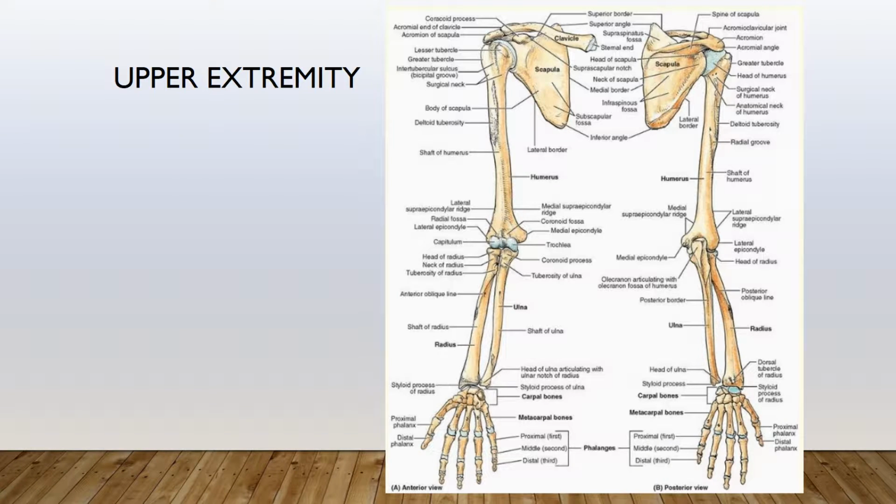Now, the first thing I want to do when I receive a requisition is make sure that the requisition has the appropriate CPT code. CPT code is current procedural terminology code. So for example, if a patient was coming in for a right hand x-ray 3-view, that would be a different CPT code than a left hand 3-view x-ray.